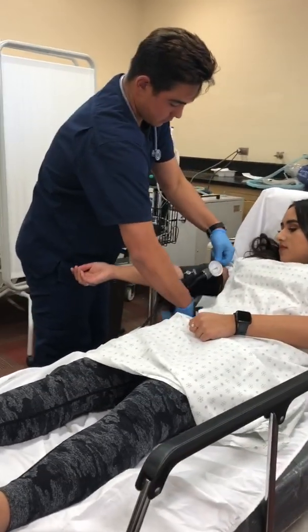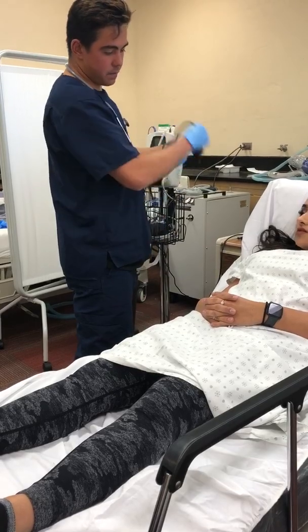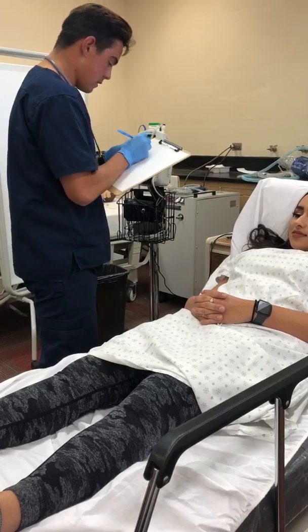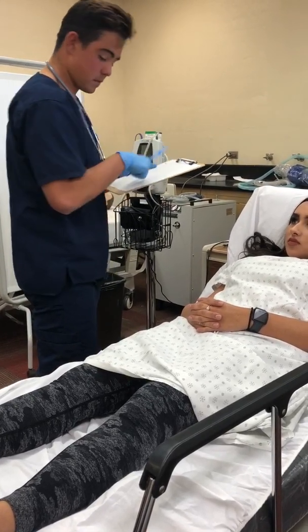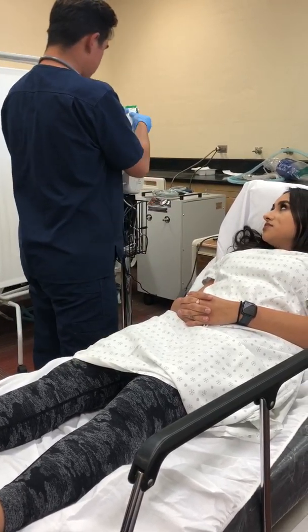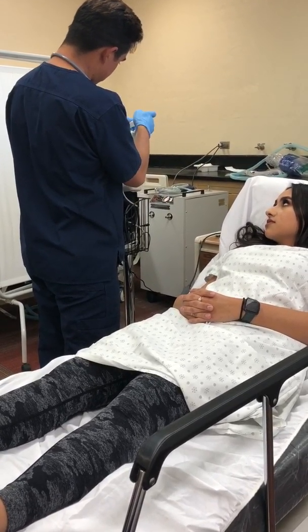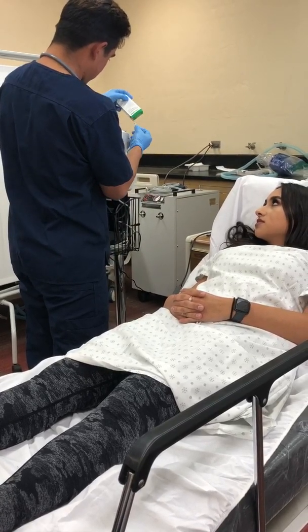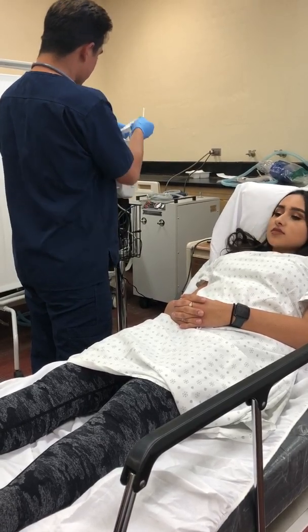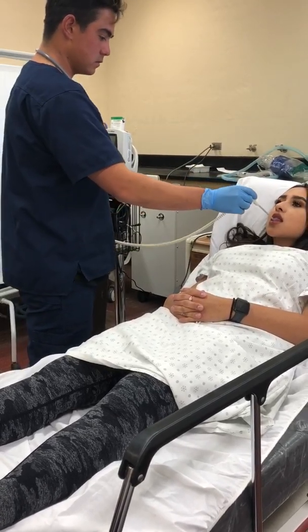Take this off your arm. Are you in any sort of pain right now? No. Physical pain. Pain. All right, I want to take your temperature if you don't mind. Okay. Can I have you put that underneath your tongue? Thank you.